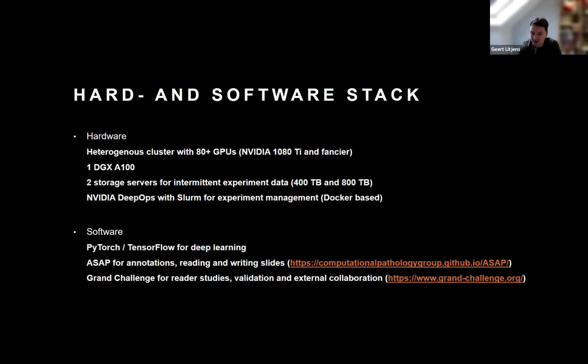Extended it quite significantly. It's open source. We have a lot of open source extensions, the most recent for reading DICOM whole slide images. And we also have some internal extensions that were in collaborations with manufacturers so that we could read all the different types of slides we were collecting.